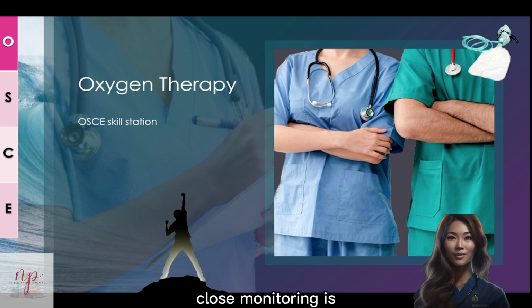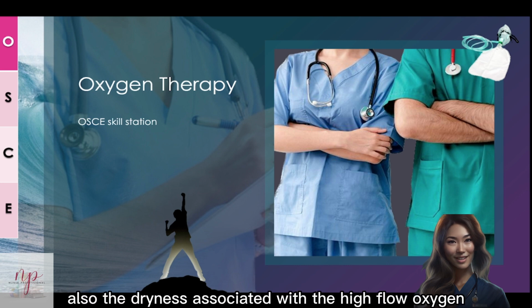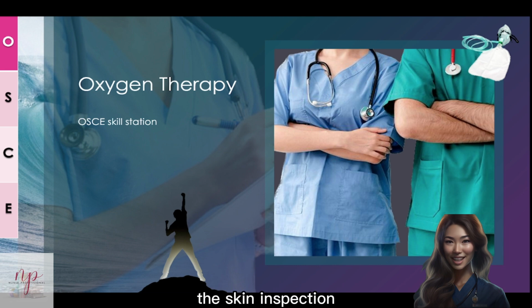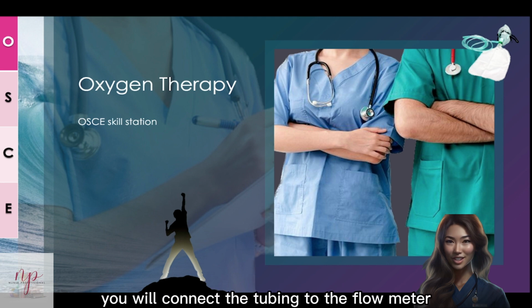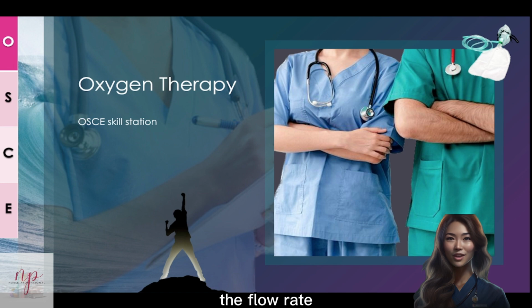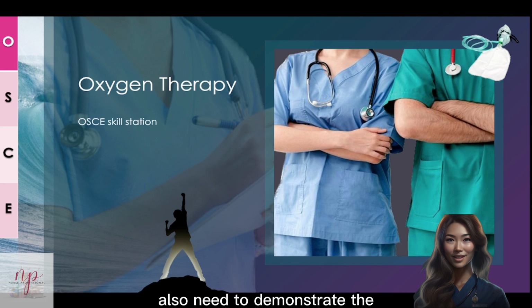Close monitoring is compulsory. So you need to monitor the patient's oxygen saturation, respiration, also the dryness associated with high flow oxygen, and also the skin inspection. You don't want any pressure sore. You also need to show your examiner that you will connect the tubing to the flow meter. The flow rate should be exactly the same as the doctor's prescription. And you also need to demonstrate the technique of using your fingers to cover the one-way valve until the bag is fully inflated before the application.